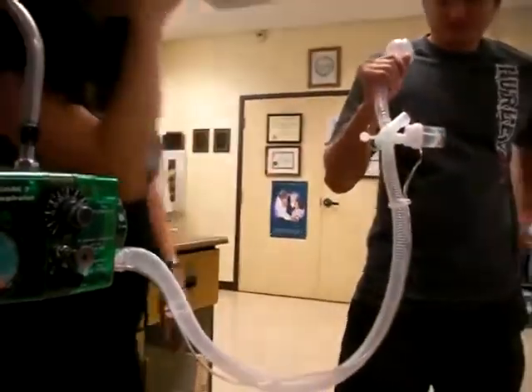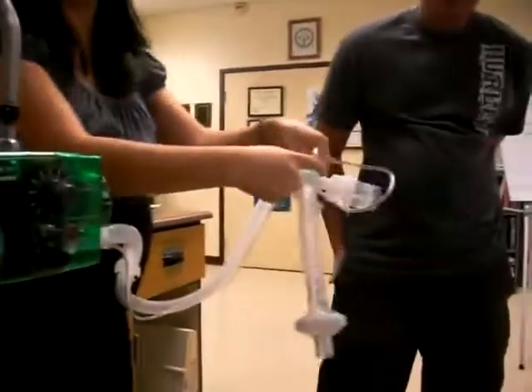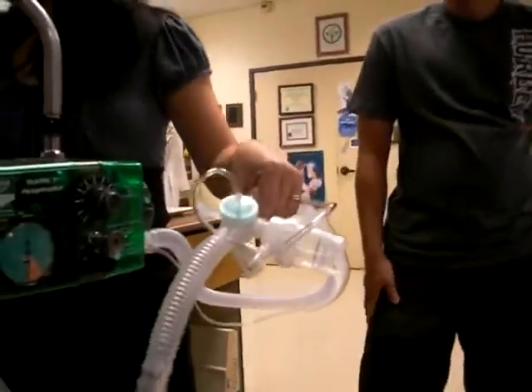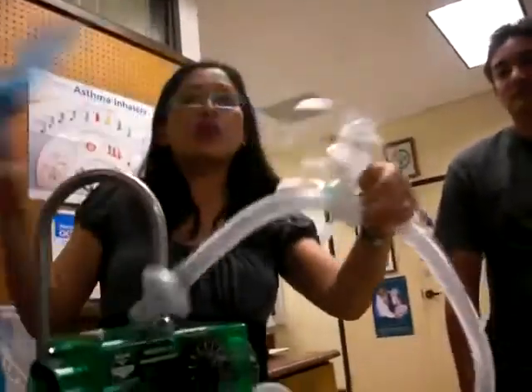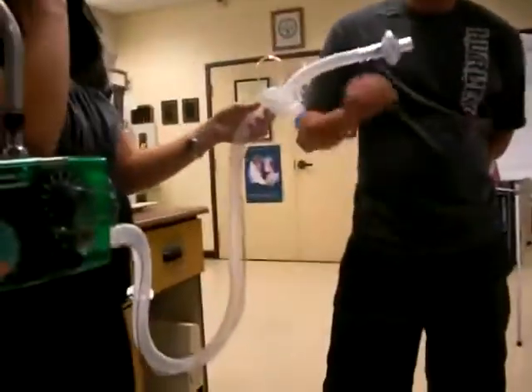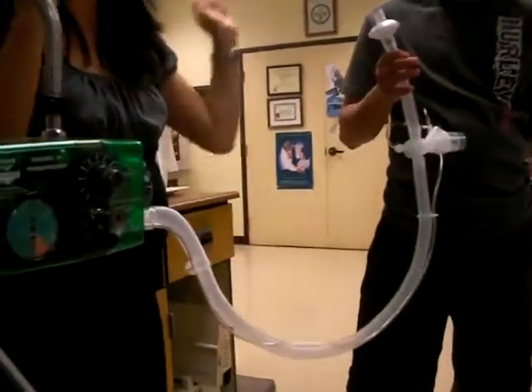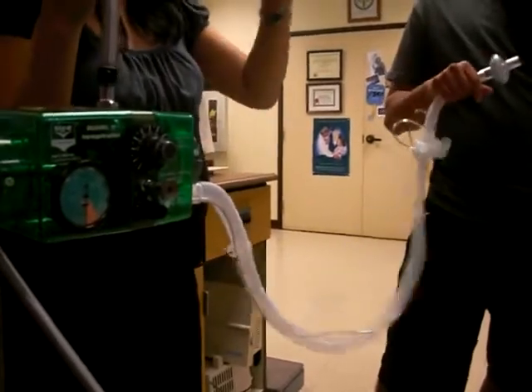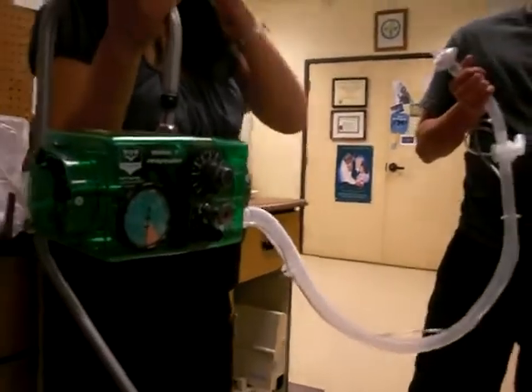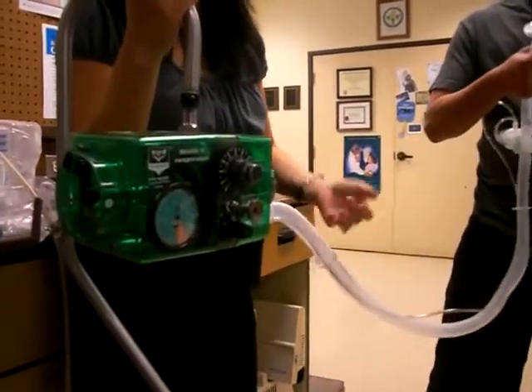Alright. A sticking breathing valve. The breathing valve is over here, that green area. For this one, it's inside. You can't see it. So if you check the leak on the patient, you check the leak on the circuit, and it's still not cycling off, probably should just change the circuit. Okay. That's how you troubleshoot. You go from one thing to another that causes it. And if everything's checked off, it's probably the circuit that's wrong.